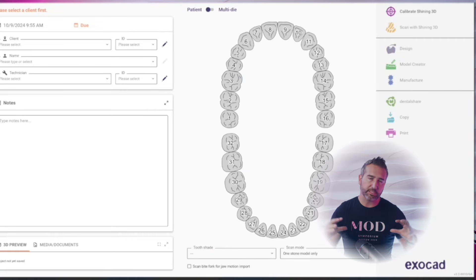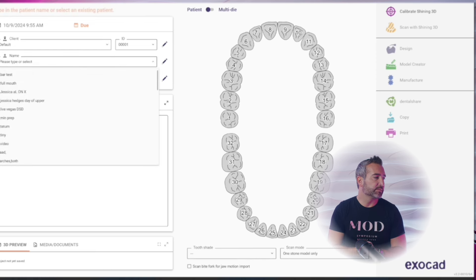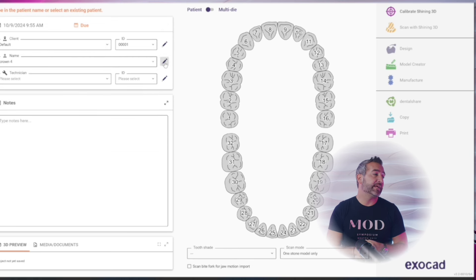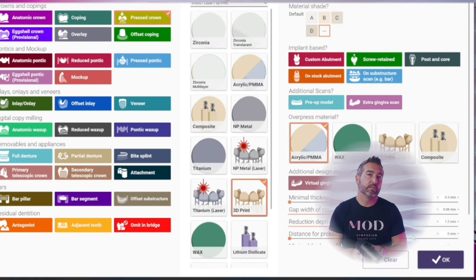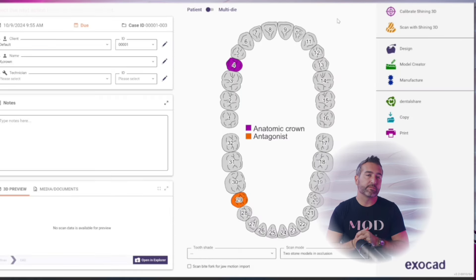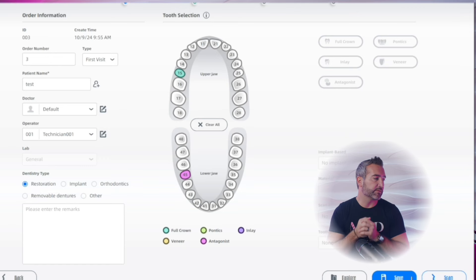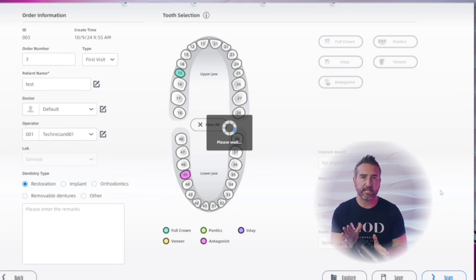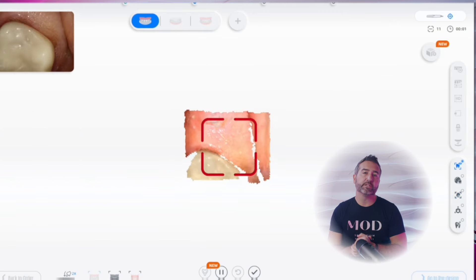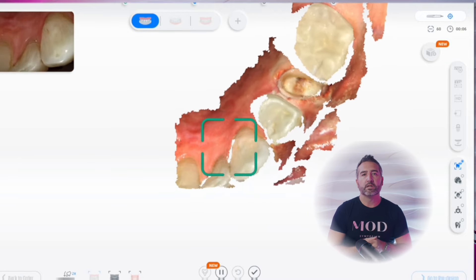The arches come in extremely fast with not a lot of pausing like you get with some other scanners. It also has phenomenal Exocad integration — you can see we're setting up a single unit crown case in Exocad, hitting scan with the Shining 3D, and it instantly pops up the scan software with the prescription already filled out. There's nothing extra to do — you just go right to scan. Other scanners have this level of integration, but I found this worked really smoothly.